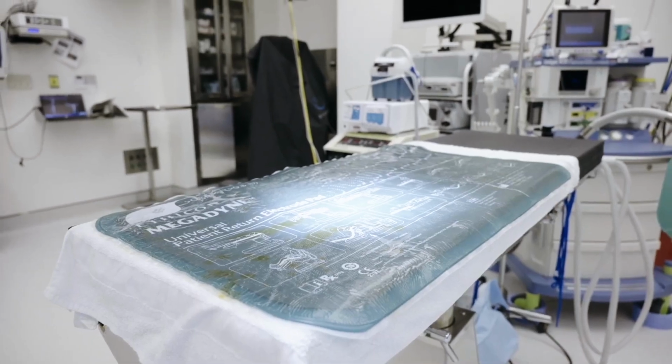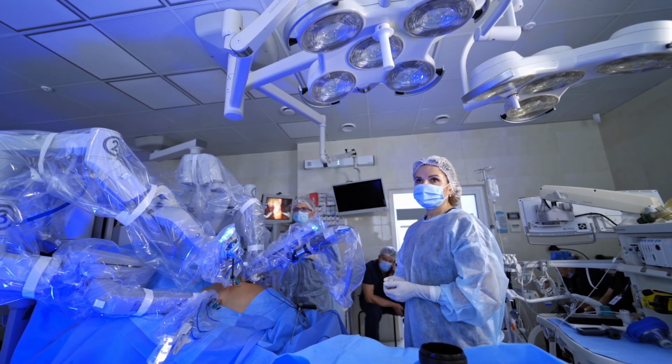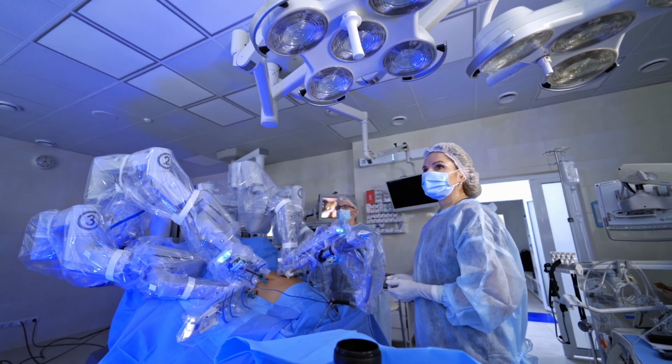So how does R2 Surgical make sure they're up to code? I mean, these are robots helping to operate on humans after all. After you've broken down, I think, the barrier of what the robot is, that the surgeon's the one actually using it, it becomes a little bit easier to explain that it's a piece of equipment. Any system that we might acquire from a hospital, let's say here in the United States, we put it through very extensive checks and balances, and with the proper maintenance, it can keep going for a long time.